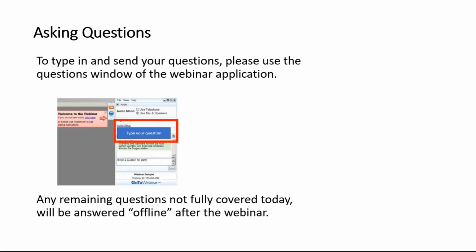Thank you very much. I have one last question, which is concerning the outlook for this treatment approach. What do you think, which aspects still need to be investigated to further promote this treatment approach in daily practice? And have you, for example, thought of an automated approach of analysis as well?